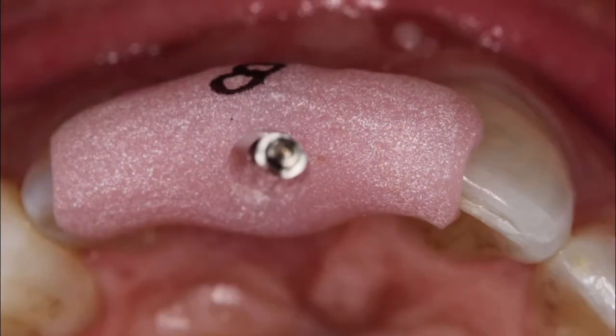The laboratory provided a seating jig, seen in Figure 22, to help position the final abutment in proper alignment, allowing for torquing of the abutment screw to 25 Newton centimeters without risk of affecting the implant.